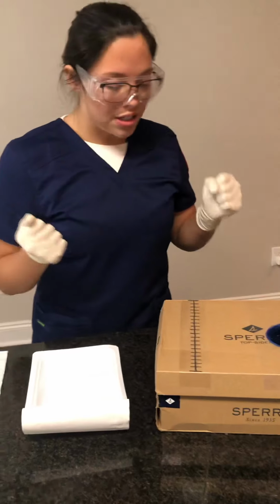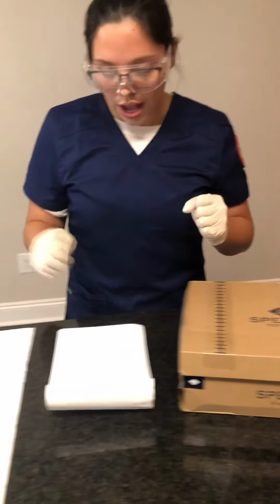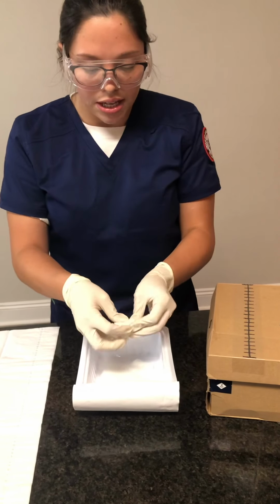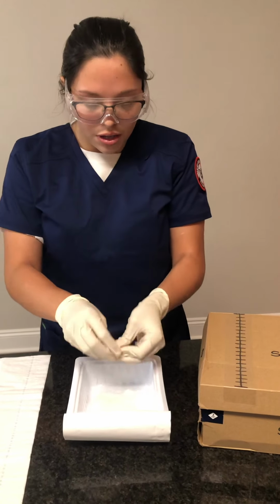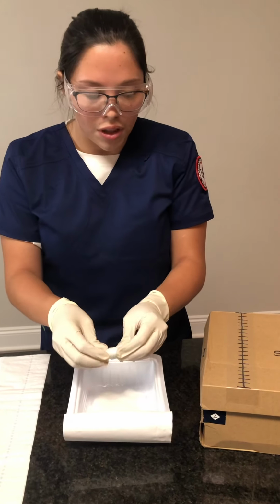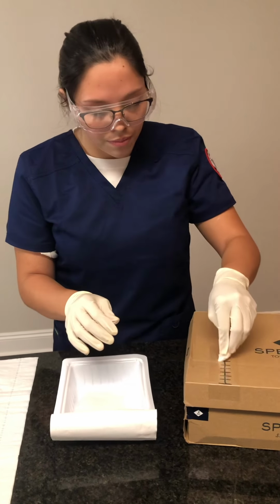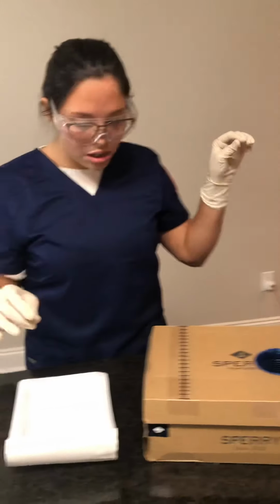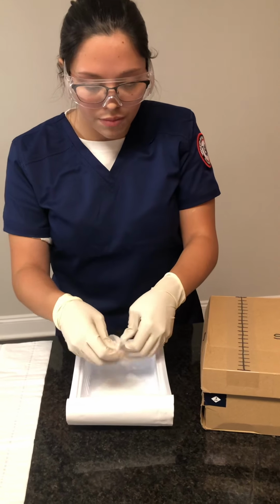I will then assess the suture for the size, the approximation of the edges, and for drainage. I will then begin cleaning the suture. I will squeeze out any saline from the gauze, and I will clean from the least contaminated to the most contaminated, starting in the middle, and drop the gauze in the trash can, and then I will repeat this onto the right side.